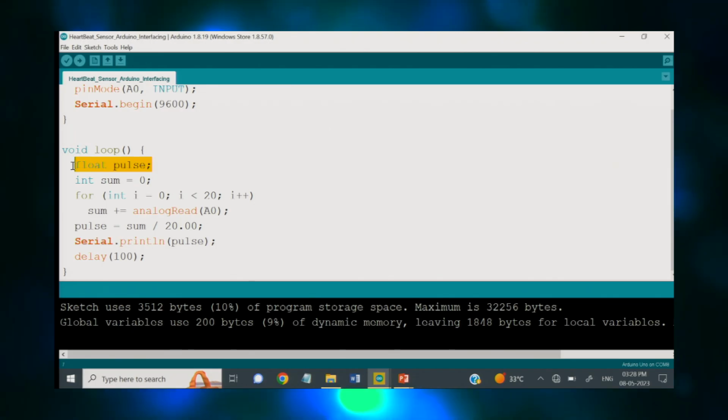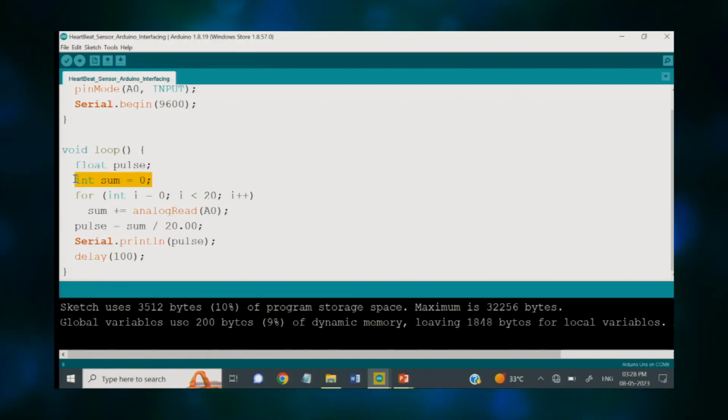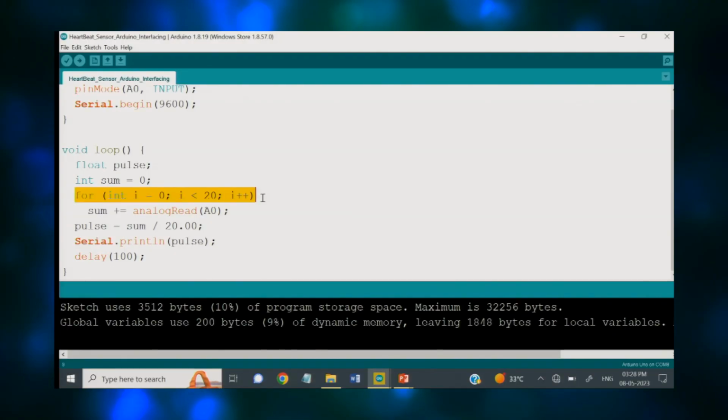variable as a float, and after that I have declared a sum variable with initial value 0, which is basically an integer variable. I will be utilizing it further to create the sequence of pulses that we will be getting from the analog terminal. And for this, I have added a simple for loop sequence.